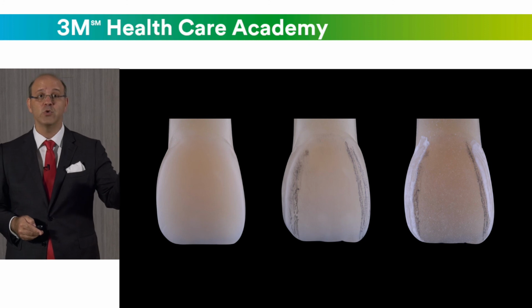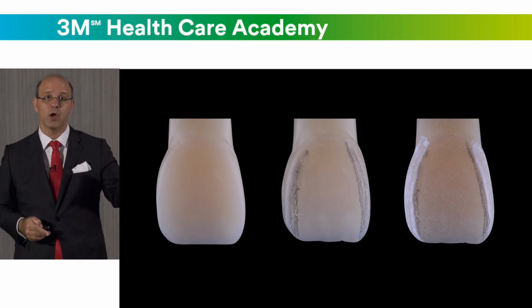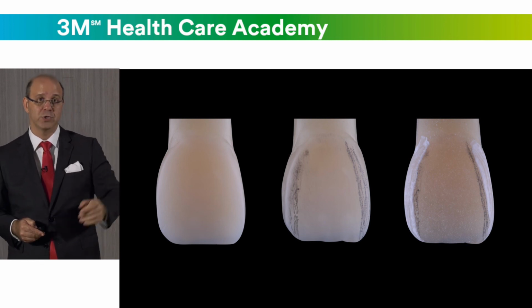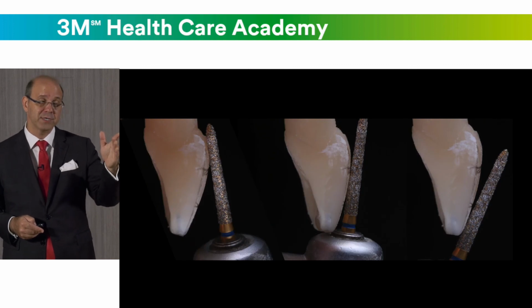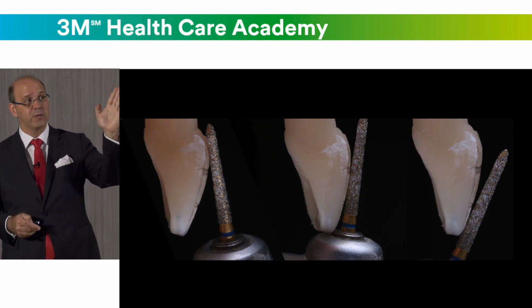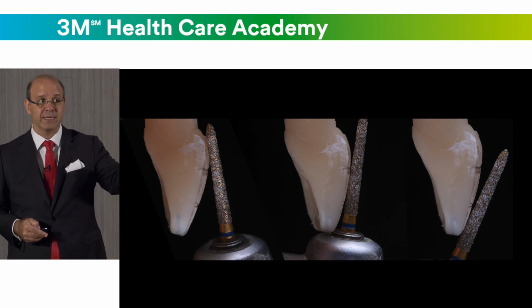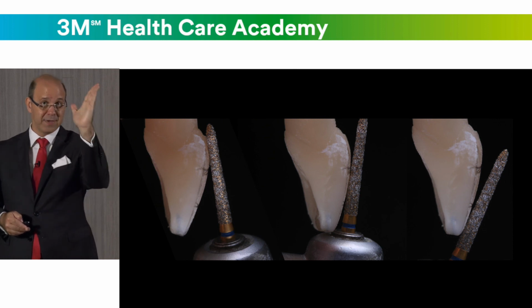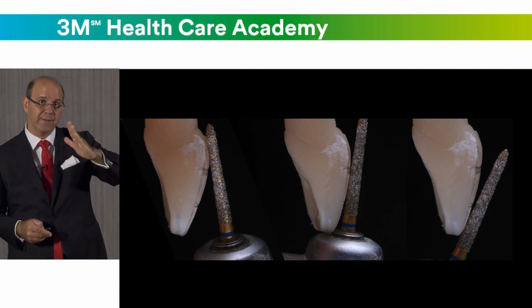Another way is to use a soft flat disc, medium grain, like the dark orange, for example, also at 45 degrees to the tooth surface. Then you go for the inclination of the thirds. Put your burr in the way you want to reapply the area you want to correct, the cervical third, medium third, or the incisal third. But the inclination of the burr is important to get this profile.